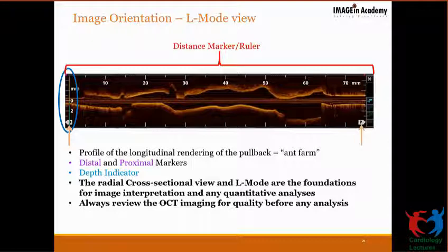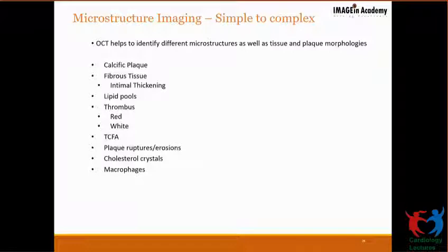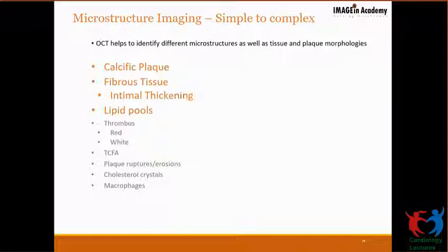So once you've acquired the image, there are different morphologies which you will get to see. As shown in the slide, you will be able to see the different kinds of plaques. You can see intraluminal filling defects like thrombi, both red and white. You'll have some changes in the vessel wall, primarily pertaining to thin cap fibroatheroma, cholesterol crystals, macrophages, and plaque ruptures. But the most important three things are the calcific, fibrous and the lipid pools, which you need to see. These are called the big threes, which you need to understand and orient yourself to, because the majority of the time you'll be concentrating on these three things.